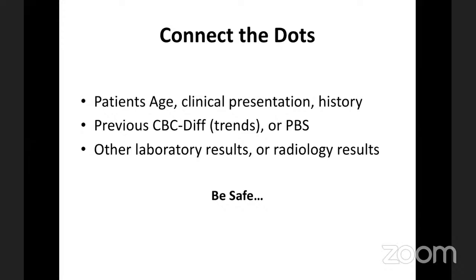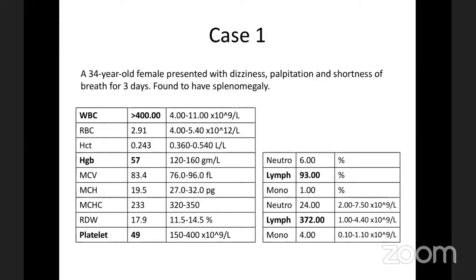Don't try to report a peripheral blood smear without correlating the patient's CBC and the other presentation, so that you will not mislabel your patient. Okay, I'll start with my cases.